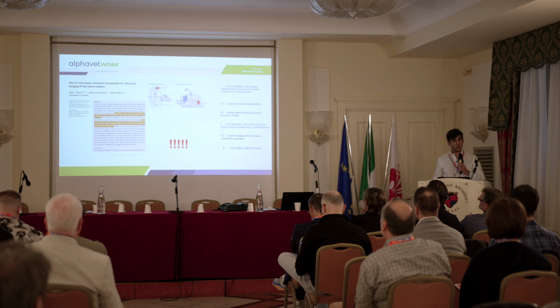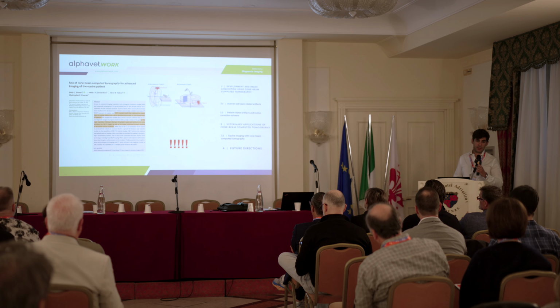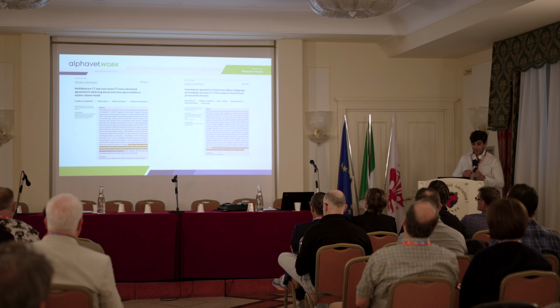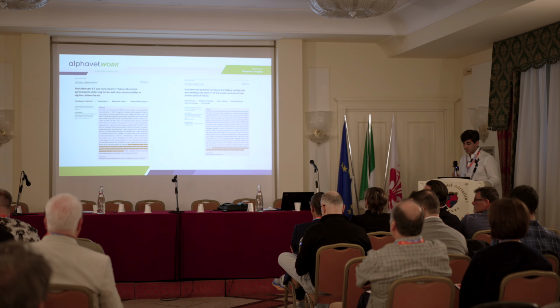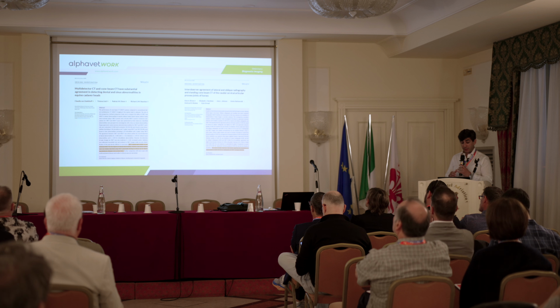It's easy to understand, for those who do equine, that CBCT has a very nice impact in equine medicine. We also have a lot of investigation about cone beam CT, with good agreement, detecting dental and sinus abnormalities in equine cadavers, and also in the caudal cervical articular process.